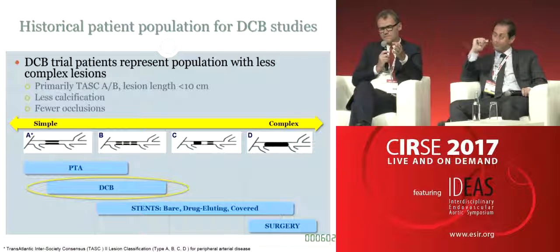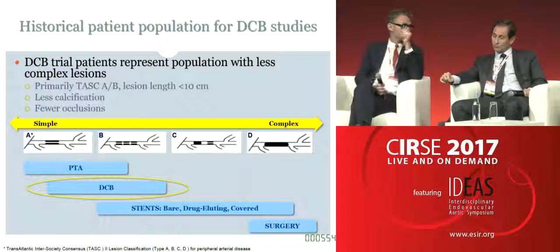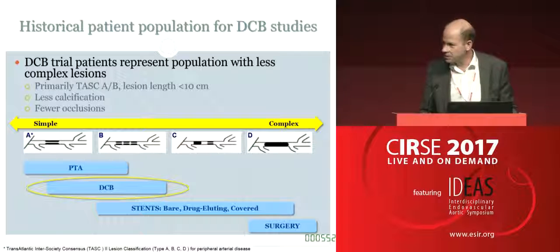Also, like morphological factors, we can take into account calcification. Do you perform a CT scan before this kind of procedure? No. And I'm going to present you only patients which are claudicants, no CLI patients right now. And we just do an angiogram very often, or have an ultrasound and just do the intervention.